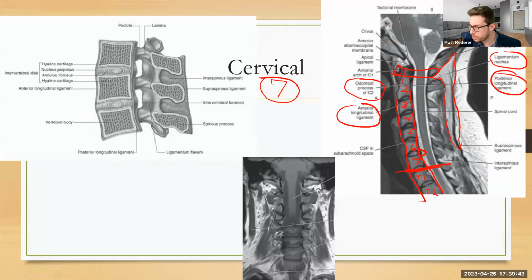All right, so we should be able to identify that one fairly easily. Is it really important for us from an imaging standpoint? No, but the radiologist might find that more important to see if there's any potential issues with that patient. It does support the head as it moves.